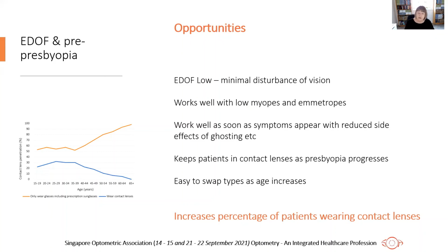You're not compromising their depth perception or stereopsis with monovision. You're giving them enhanced vision when their vision is really only just starting to feel uncomfortable. As EDOF also does not give the same effect of ghosting, it's accepted much more easily than multifocal options.